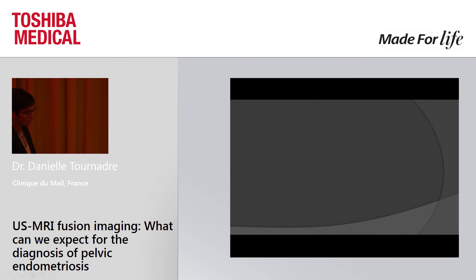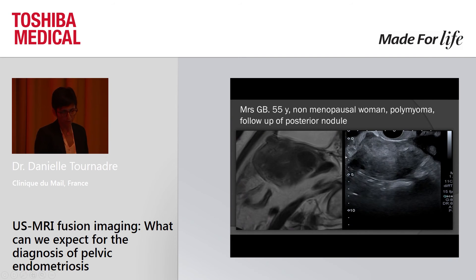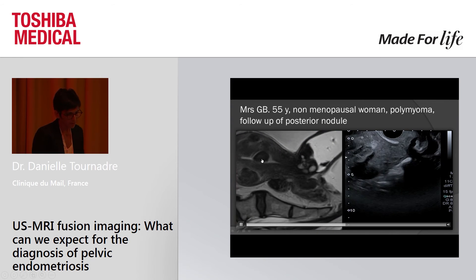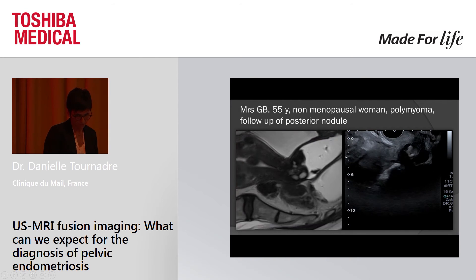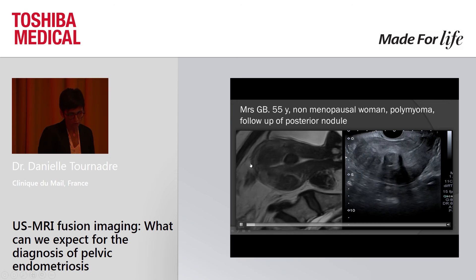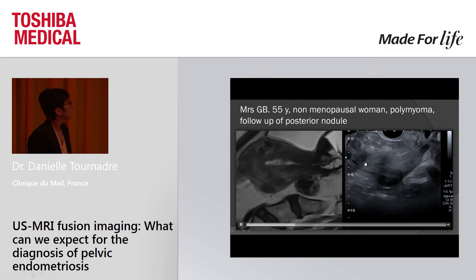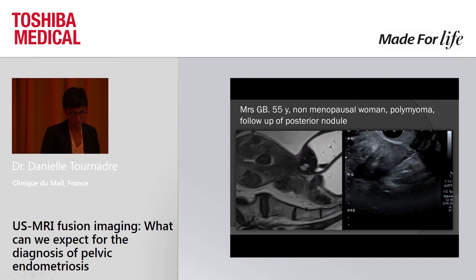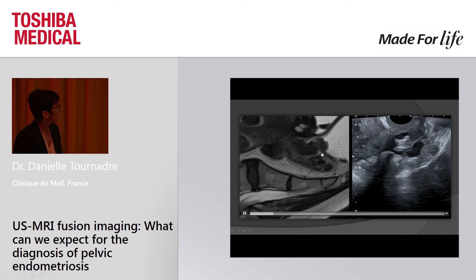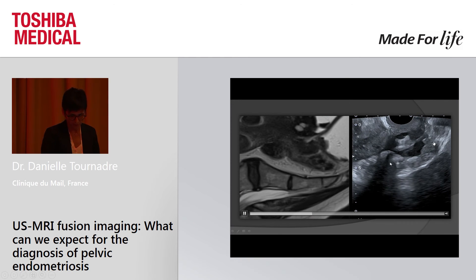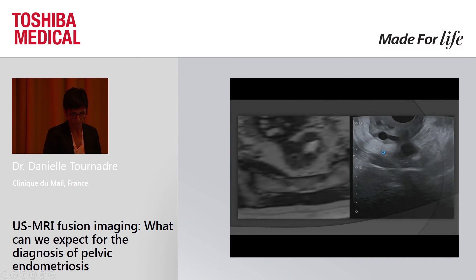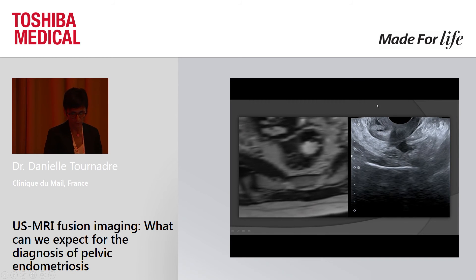Another case: a 55-year-old post-menopausal woman with a polymyomatous uterus, with a submucous myoma that facilitated synchronization. There is a large nodule on follow-up, the patient being quite asymptomatic. The nodule appears very similar on both MRI and ultrasound images. In the transversal plane also, the nodule on MRI and the nodule on ultrasound correspond closely.